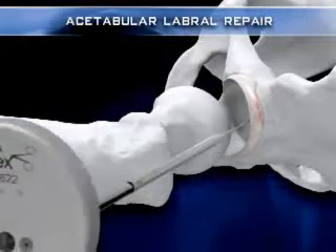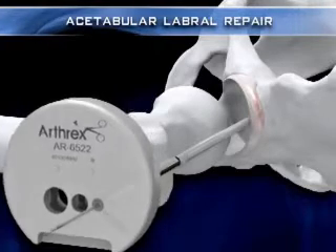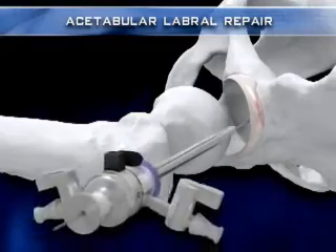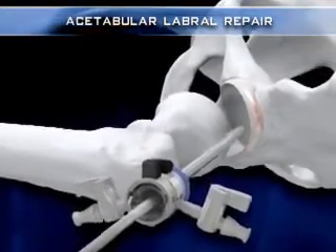A 5 mm dilation sleeve is advanced over the flexible wire to atraumatically dilate the hip capsule. The arthroscope sheath with cannulated trocar is then introduced into the joint over the wire, allowing for introduction of the arthroscope.